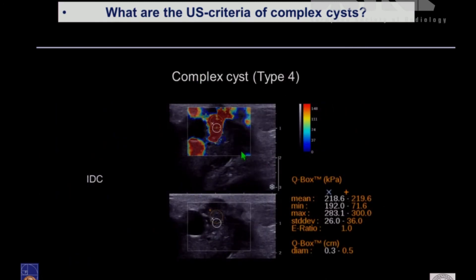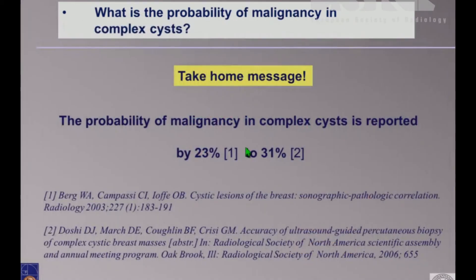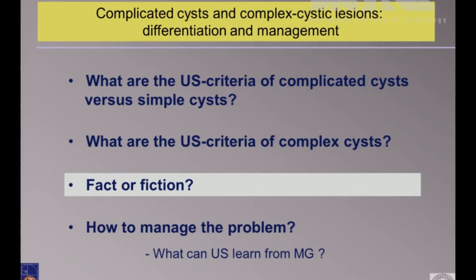Another complex cyst Type 4 with shear wave elastography: you see cystic components and solid components — very hard components compared with the cystic fluid. The take-home message: the probability of malignancy in complex cysts is reported in literature as 23% to 31%. That means if you have a complex cyst, you can't follow it — this is definitely no BIRADS 3 situation. You have to go for histology to clarify what the pathology is.